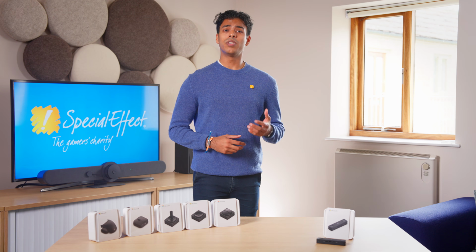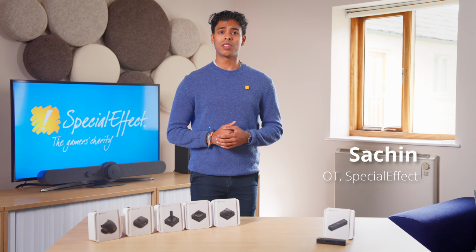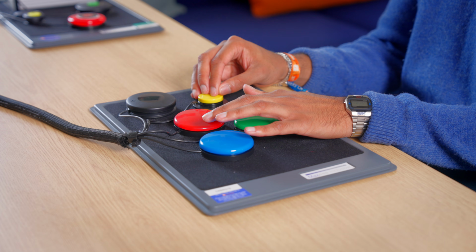At SpecialEffect, we use a range of switch interfaces. Some are designed specifically for playing video games, and some are designed for more general computer access using switch scanning. However, they may also be used in some instances for accessing games.